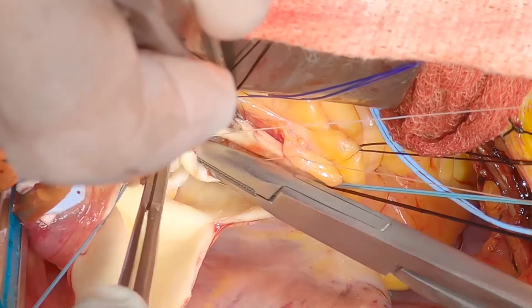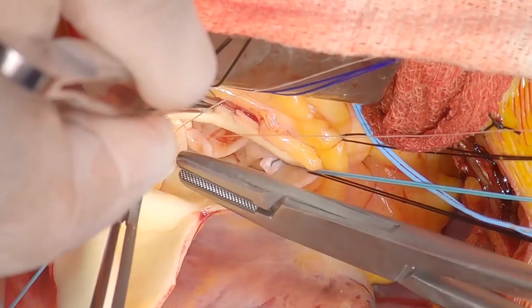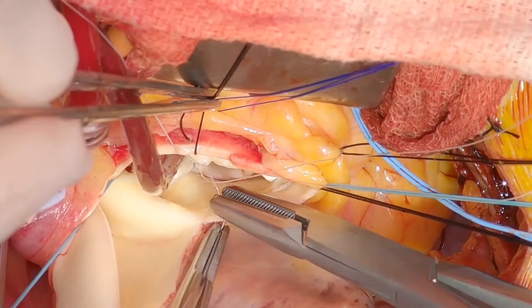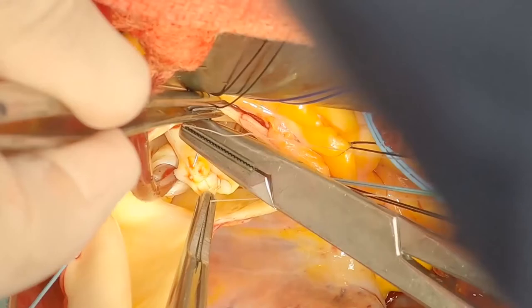The tissue on the right side of the commissure tends to be a bit thicker in most of these patients, so I tend not to make this plication always central but perhaps a bit more towards the right coronary part of the leaflet. Then I lock the sutures so I can put the progressing repair under tension to get a better idea of what it's going to look like.